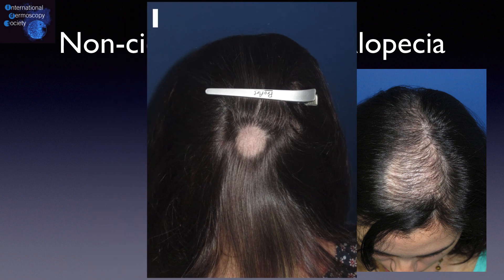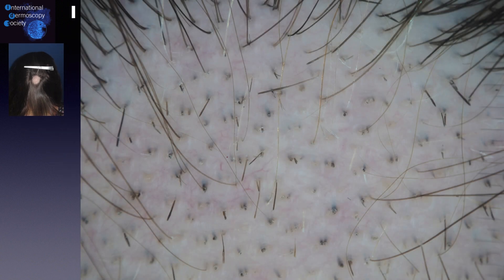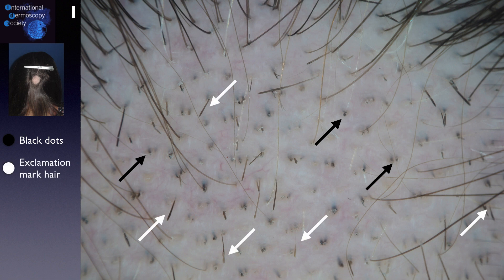The first patient has a round plaque on the occipital area. From trichoscopy, we can see many dystrophic hairs, mostly black dots or cadaveric hairs, and many exclamation mark hairs. It is also possible to notice vellous hairs along the lesion.